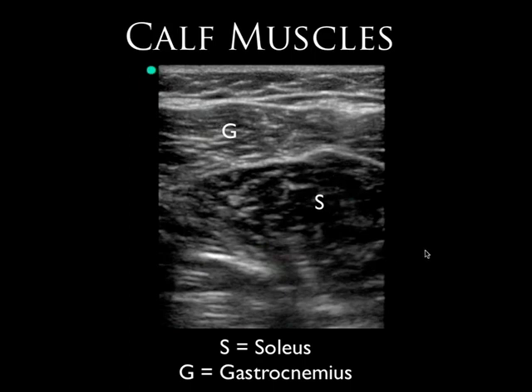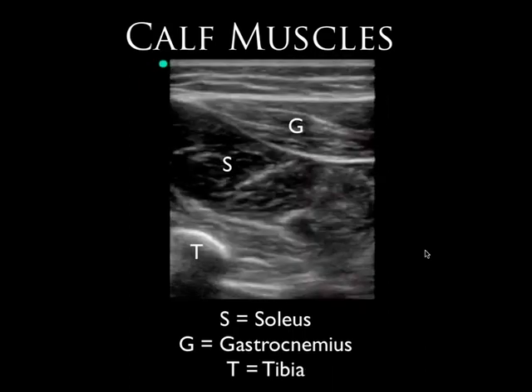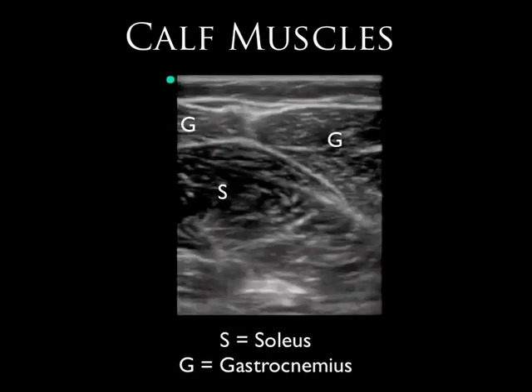Now, as I move down through these still images, we're going to go a little more distal here. And as I go distally, we can see the gastroc kind of starts to go away. The soleus remains pretty prominent. Now we can start to see the tibia down here more medially. And then we can see two bellies here of the gastroc. The soleus is down here.